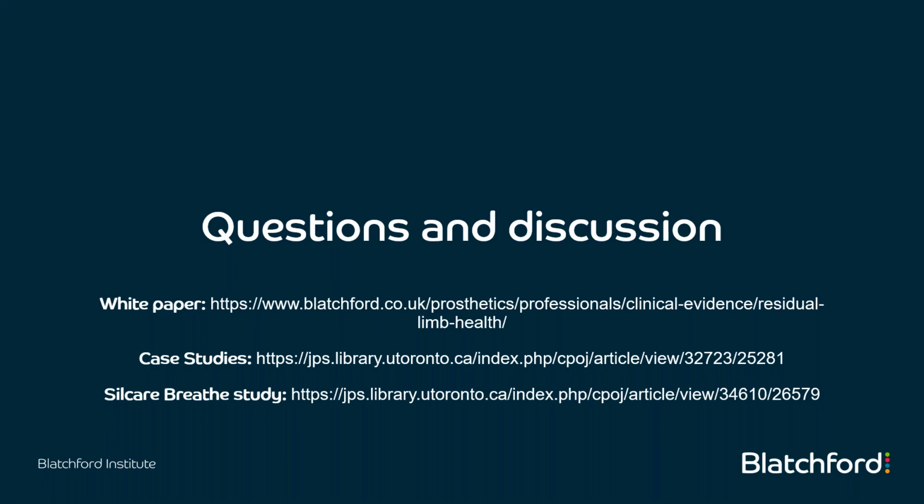The first question is, do you need to have a one-way valve on the socket to use the EchelonVAC? The short answer to that is yes, and ideally one that allows air to expel from it automatically as well, to get any air out of the system in the first place very quickly, to allow the action of the ankle, the vacuum, to draw the vacuum out from the socket. So yes, it's quicker, and an auto expel valve on there is probably the best thing to have.